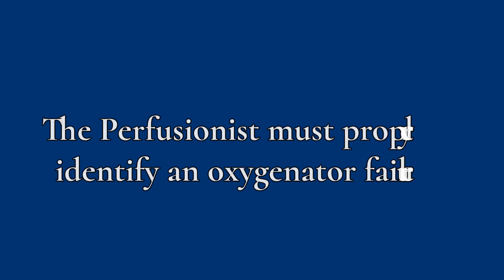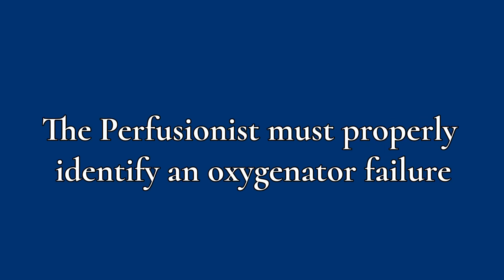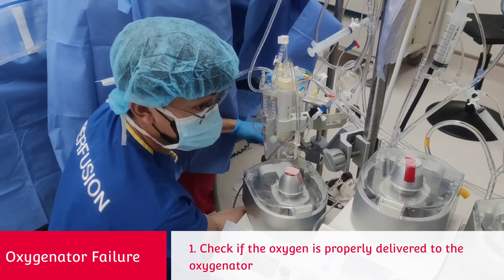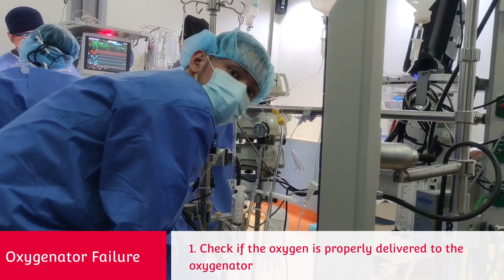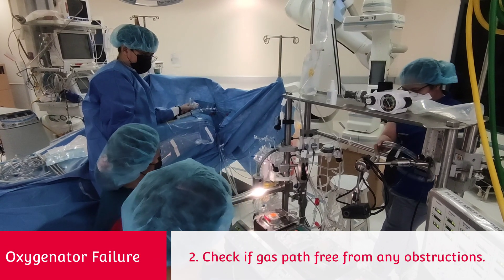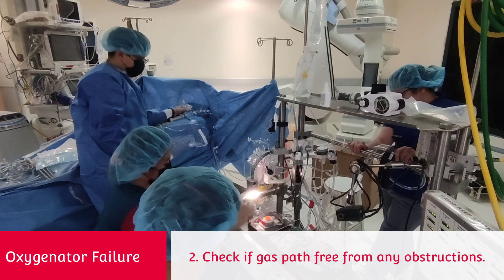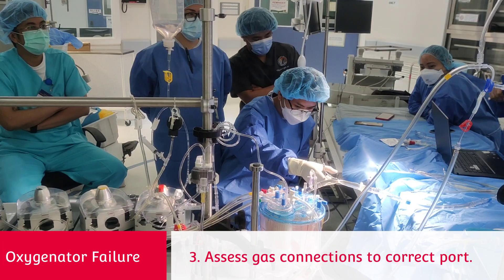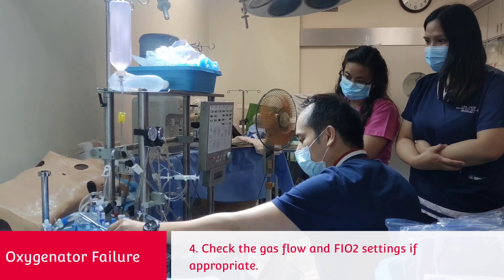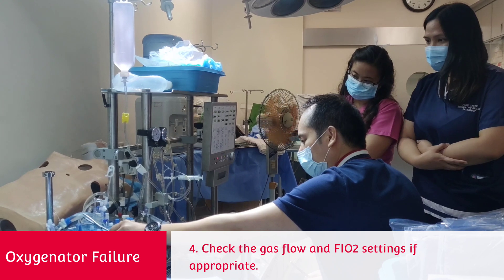The perfusionist must properly identify an oxygenator failure by evaluating mechanical considerations before oxygenator change-out. First, check if the oxygen is properly delivered to the oxygenator. Second, check if the gas path is free from any obstructions. Third, assess gas connections to the correct port. Lastly, check the gas flow and FiO2 settings if appropriate.